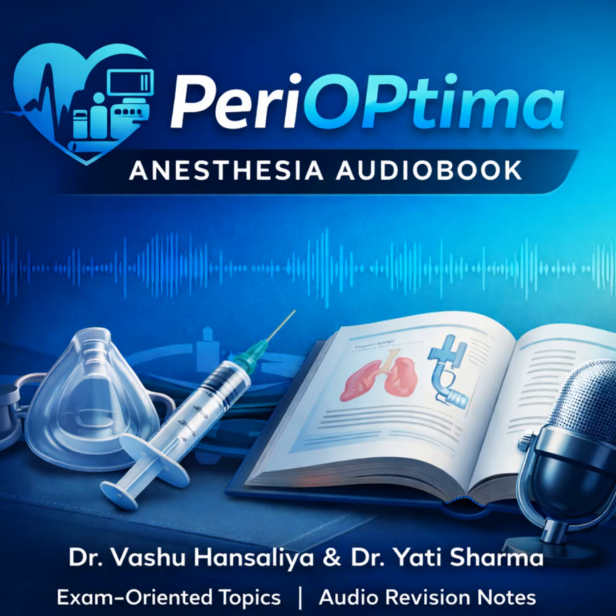O2 failure devices. The O2 failure protection device automatically interrupts all non-O2 gas flow when O2 pressure drops below that critical 20 to 30 psi threshold. It prioritizes safety. Hypoxic guard mechanics. Proportioning systems, which you can illustrate with the 3-to-1 gear ratio concept, guarantee a minimum FiO2 of at least 25%. And the hypoxic guard limitation. Critically, these systems only protect against user error in dialing the wrong ratio. They are completely vulnerable to a catastrophic cross-connection upstream.